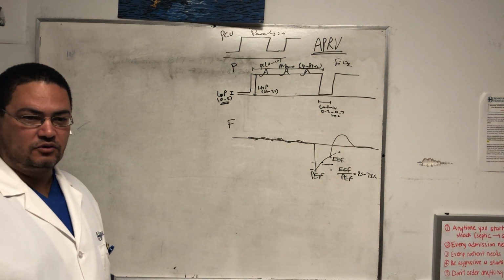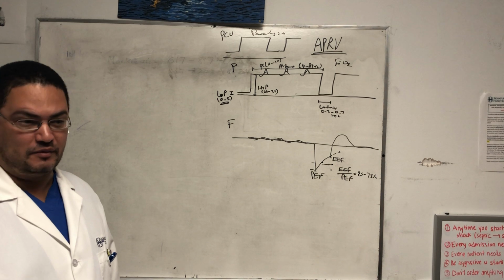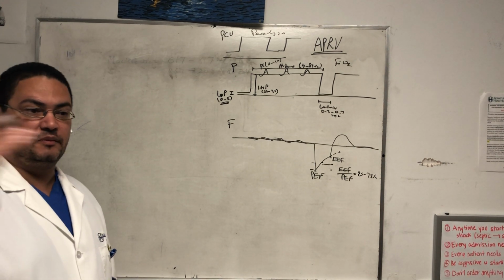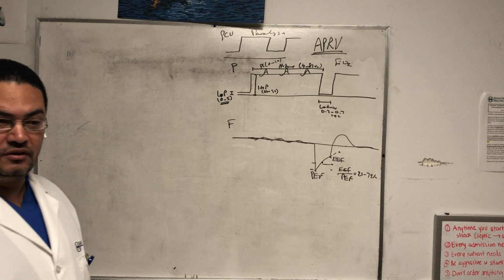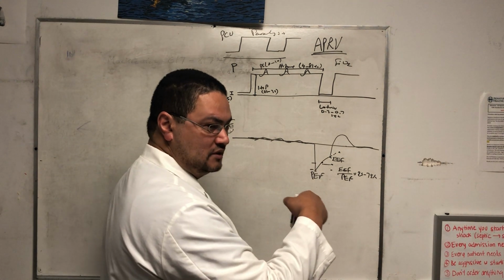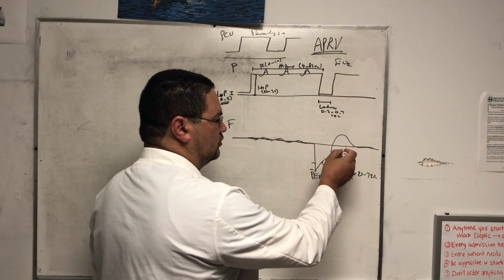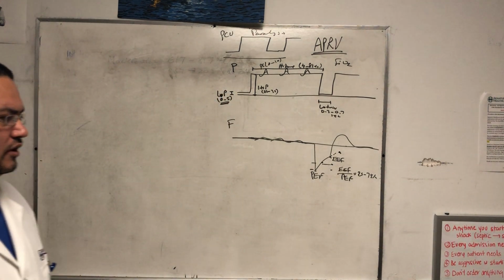So if the lung sees 0 to 5, you're an ARDS patient and I give you a low pressure of 5, that means you're gonna have de-recruitment, and then the next breath comes in and opens the whole lung again and causes severe inflammation. So that's worse than hypoxia. Actually, it scares me more than hypoxia. So anyway, this means that you de-recruit the patient. You need to reduce the low time.